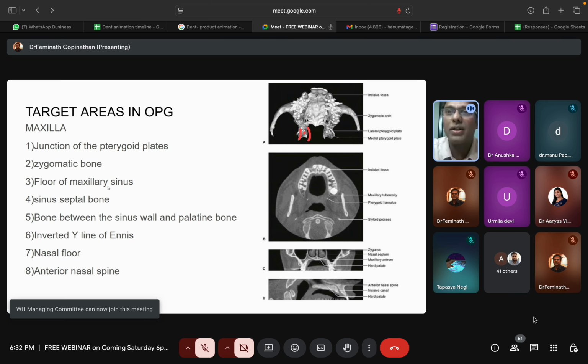You people always say basal implants, cortical basal implants, is a failure. You know why this is a failure? Because people do not follow all these protocols. That is the reason why it fails. If it is done properly, it will not fail.